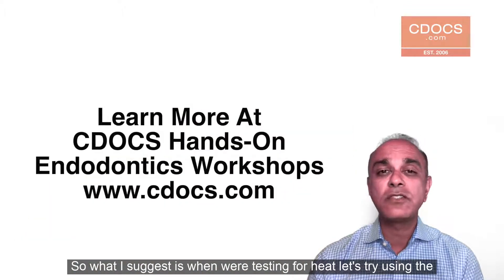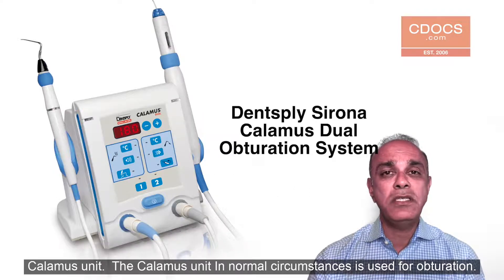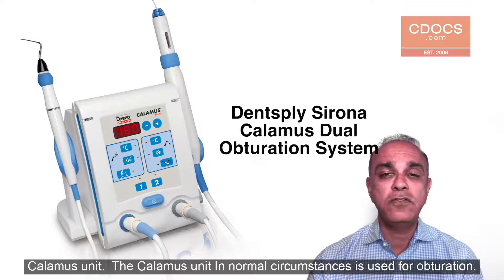So what I suggest is when we're testing for heat, let's try using the Calamus unit. The Calamus unit, in normal circumstances, is used for obturation.